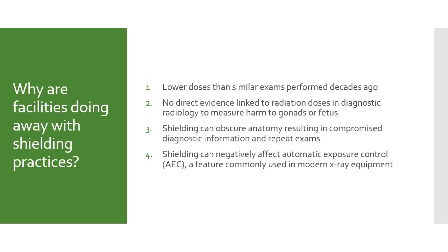As stated earlier, there have been recent changes to the shielding policies at several clinical sites. For this reason, students must make sure that they understand the shielding protocols at each site and follow the procedures set forth by each facility. At HAC, shielding is still being taught and should be performed on all exams, in the lab, and at the facilities that continue to promote shielding practices.